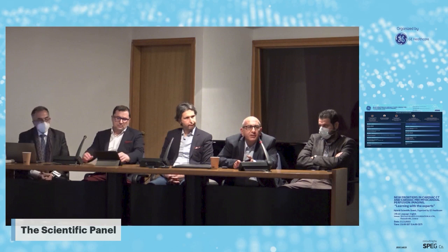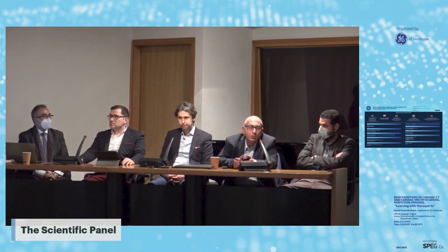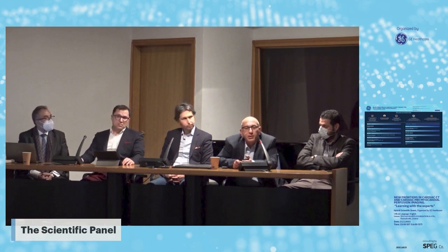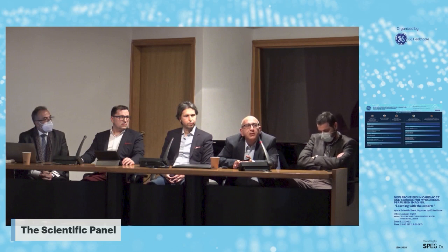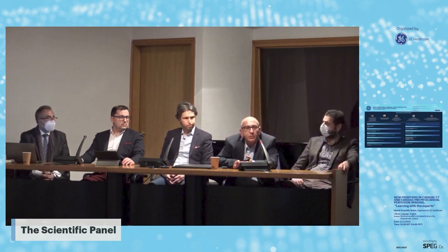And the third thing is something that says it by itself: practice ALARA. All of us radiologists have to know the ALARA concept, as low as reasonably achievable, meaning that radiation is not such a bad thing, but excessive and wasted radiation is a problem. We have to utilize as much radiation as needed to answer our clinical problem and not just to make beautiful images. Because the method is here to stay and to give a lot, and it's going to be applied to a lot of people, it has to be low dose. We have to practice the method like this. Thank you very much, and it was very nice.